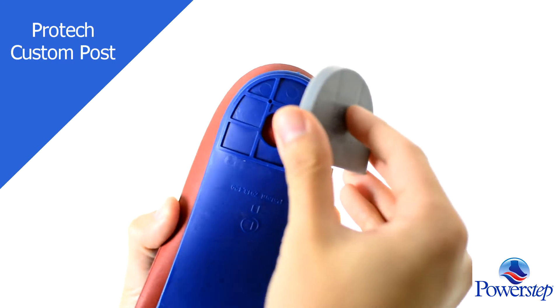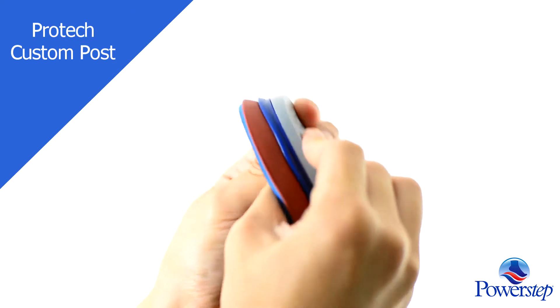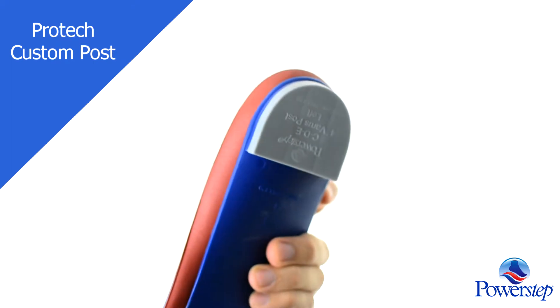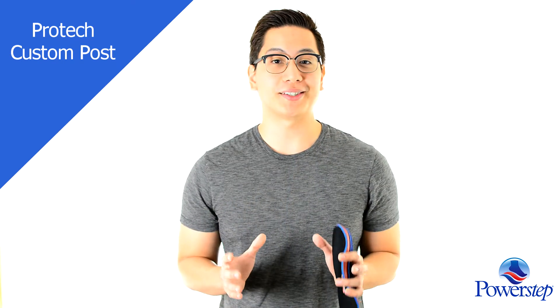With the option of three heel postings and two heel heights, Custom Post can easily be tailored to anyone's needs. With double-layered cushioning and a firm shell, the Custom Post relieves moderate to severe overpronation and other common foot conditions.